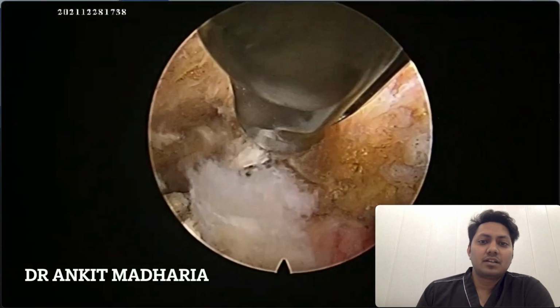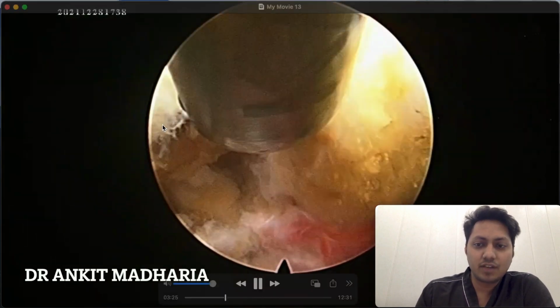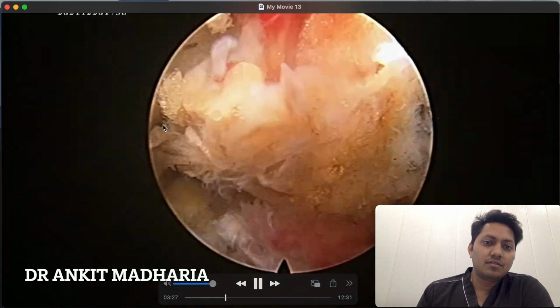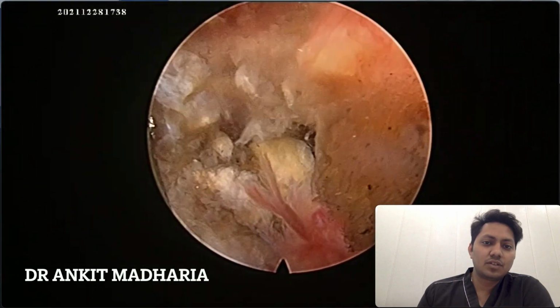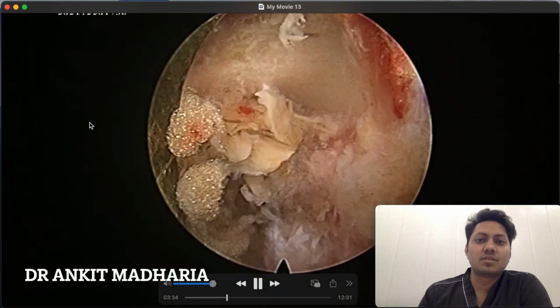Now mind it that the bone in these patients is not very hard, and it is not always required to use a high speed instrument to clear these bones.